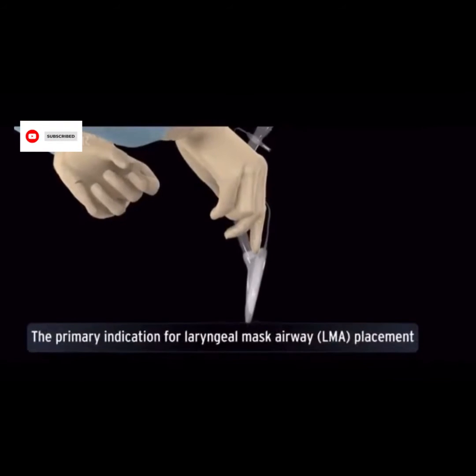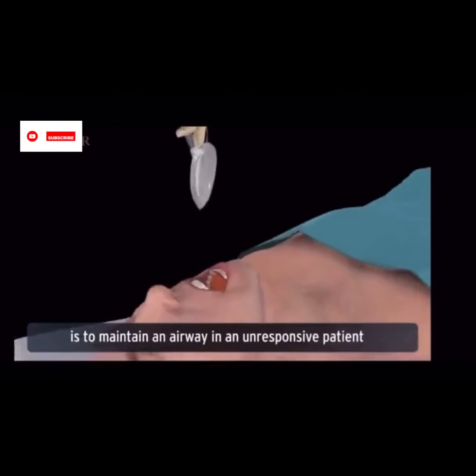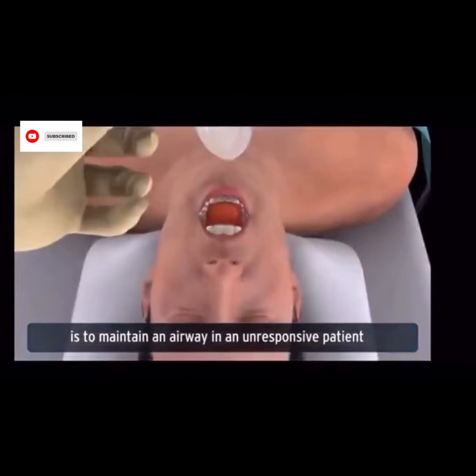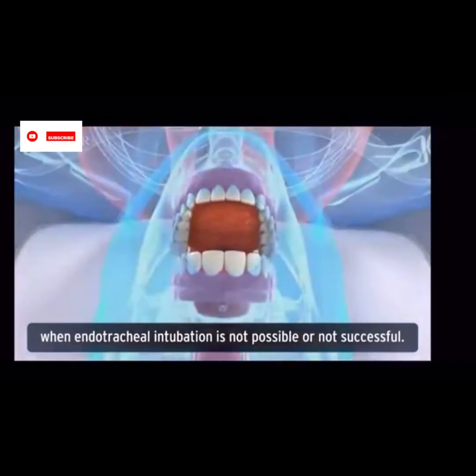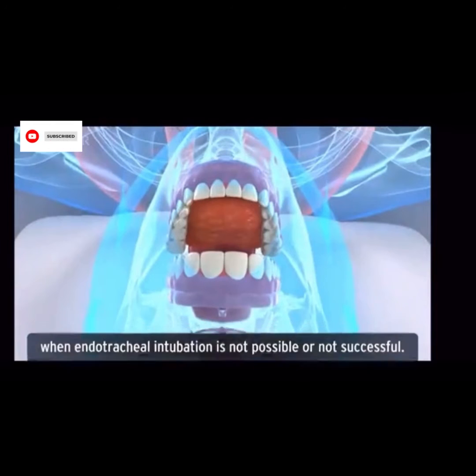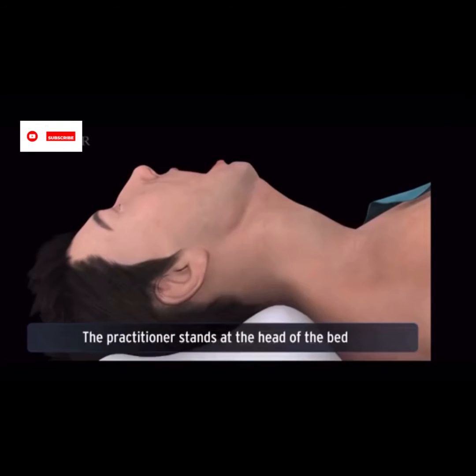The primary indication for laryngeal mask airway (LMA) placement is to maintain an airway in an unresponsive patient when endotracheal intubation is not possible or not successful. The practitioner stands at the head of the bed and positions the patient.